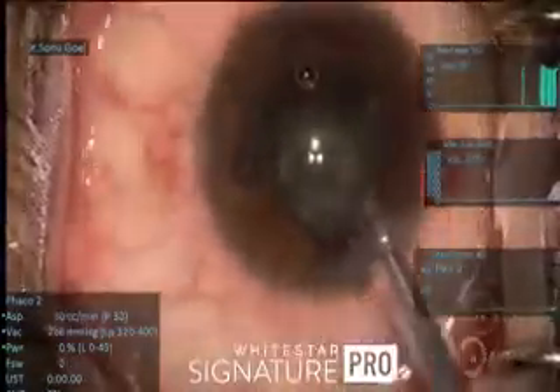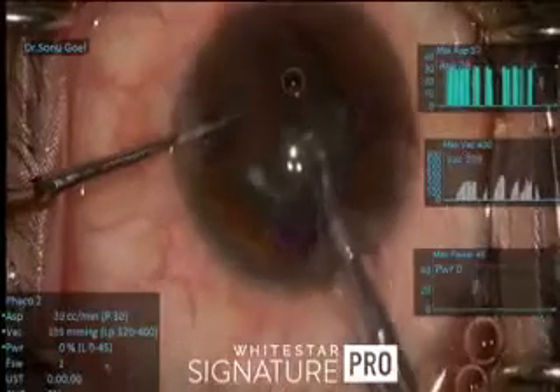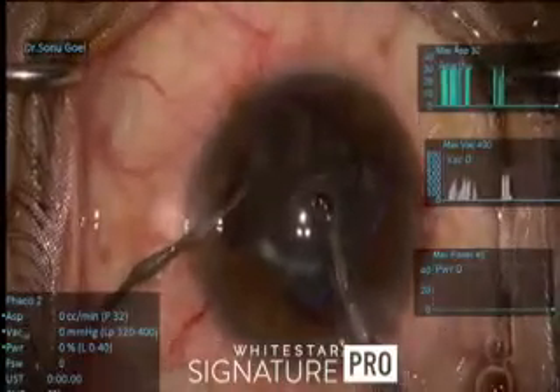The nuclear matter is hardly aspirated — there is hardly any energy to be used here. We are using a Signature Pro system. Viscoelastic from the side port is always injected before removing the handpiece.